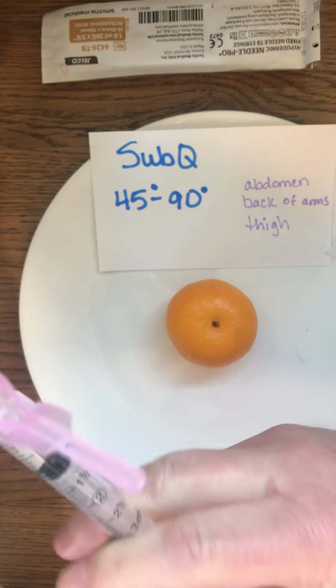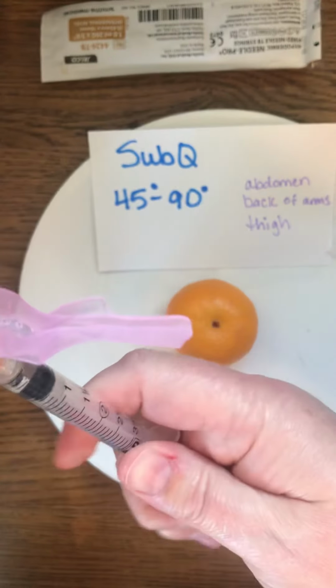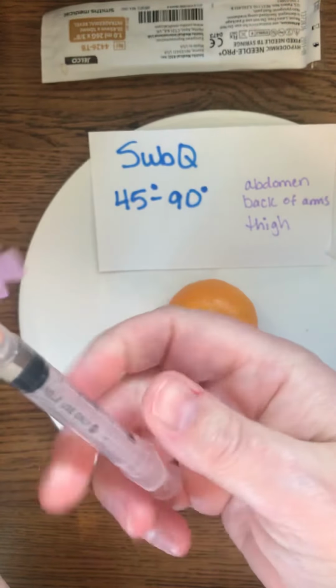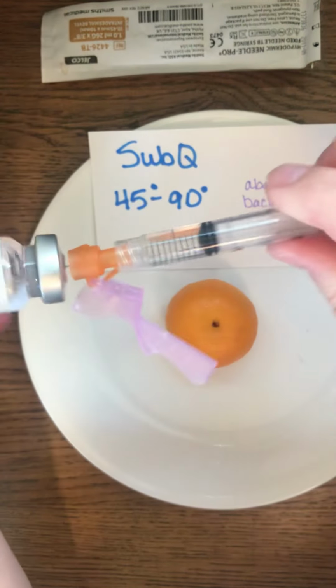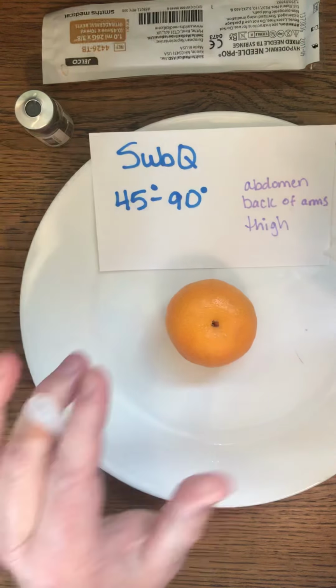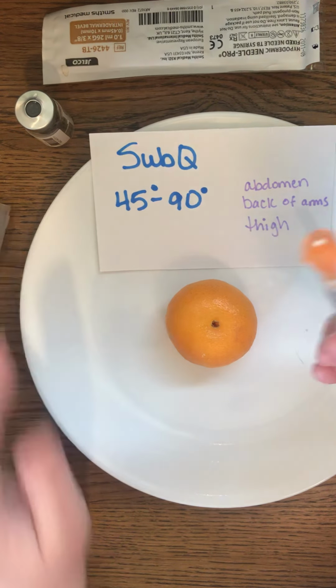And again, these smaller needles are not going to be able to draw up solution quite as quickly because they are small. And again, you want to make sure you get all your air bubbles out. So there we go. All right, so we've already cleaned our person. And again, if we're not putting down our needle, we don't even need to worry about this.